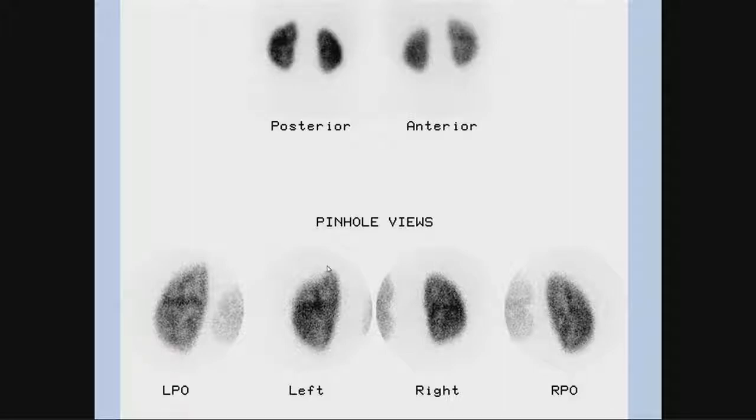Now, this is what I was talking about here, the left upper pole. Years ago, 4 doctors in Sydney involved in paediatric nuclear medicine decided to review 300 DMSA scans, and generally there was excellent concordance, but there were a few cases where we couldn't agree. And this was one case where there's this quite prominent impression here in the left upper pole. 2 out of the 4 thought this was a prominent splenic impression, and 2 of the 4 thought this was a cortical scar. And we don't take the kidneys out in these kids, so we don't know what the right answer was.